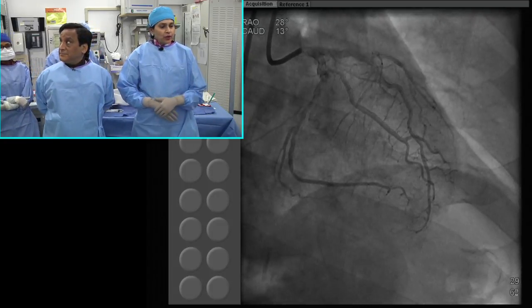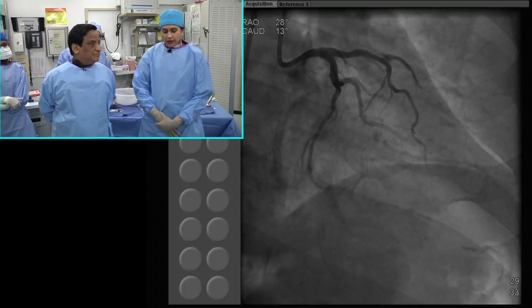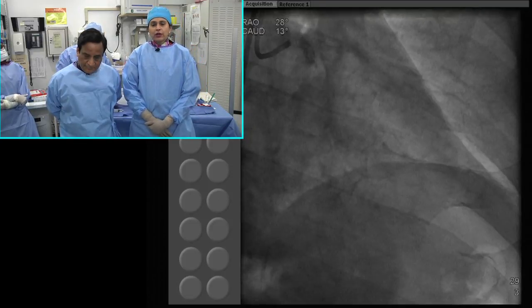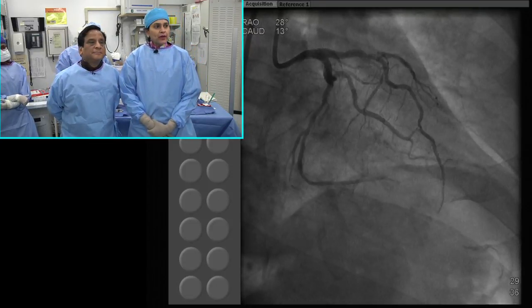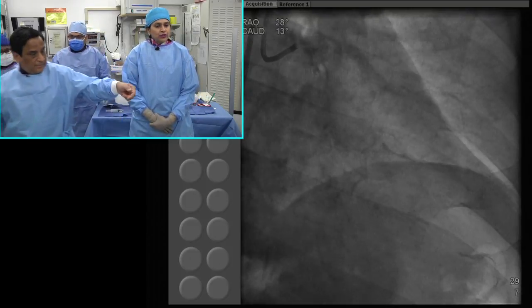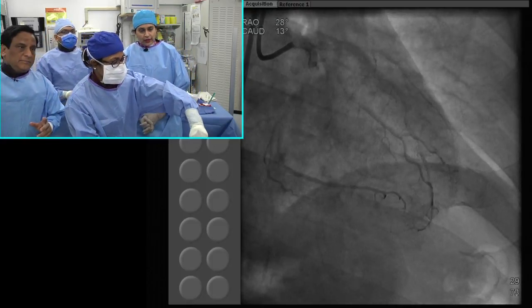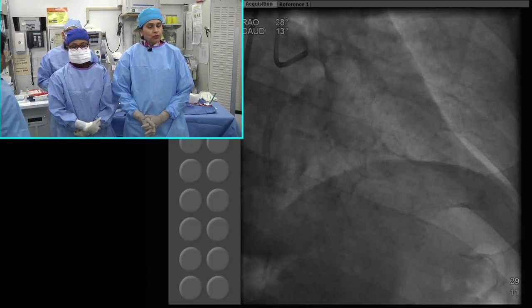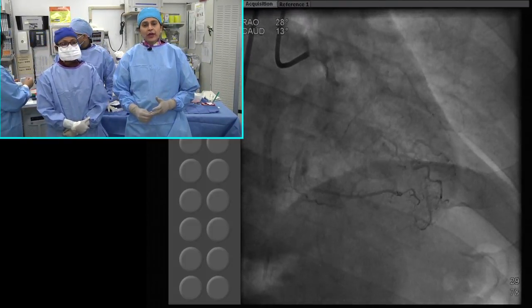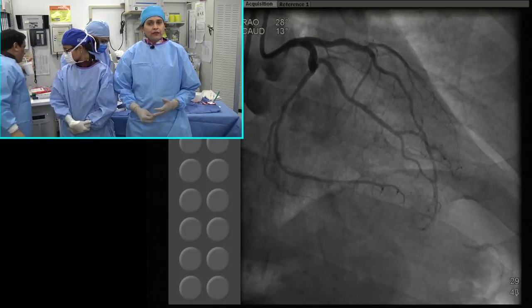And second, once you saw that there was so much calcium, decide on atherectomy, and I think I made my point why we selected rotational atherectomy and not orbital atherectomy in this particular case. And third, distal left main, large vessel, you have to do a 2-stent technique, and we have gone over the 2-stent technique, which could have been a V-stent technique. Here it would really be SKS. That means you will have 2 stents coming all the way to the mid part of the left main.